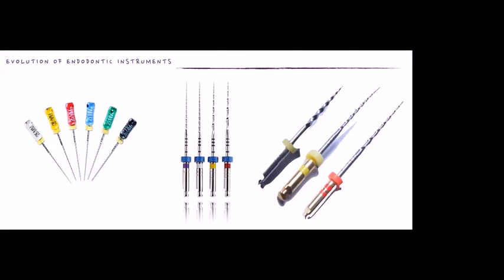At the beginning, we started using stainless steel hand files. After a few years, we started using rotary files made of conventional NiTi. And now we are using rotary files made of NiTi under thermal treatment. And as we will see later, this is very important because if we change the procedure by which the files are made, the properties of these files are going to change.